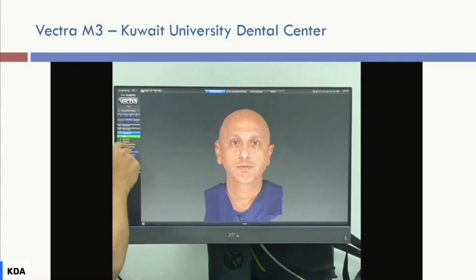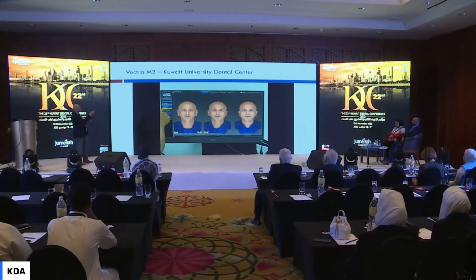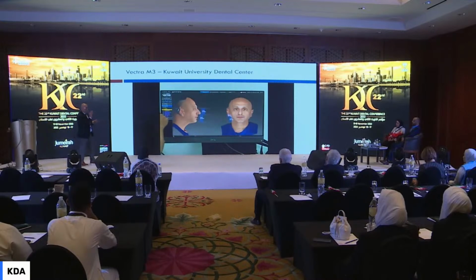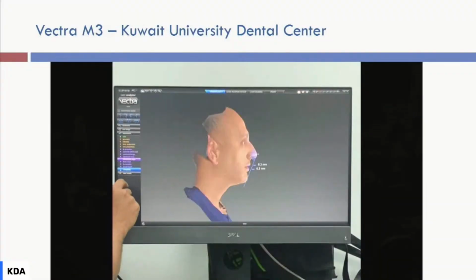We can go into assessment, so you cannot read here, but you can say, let's go about assessing, for example, facial proportions. You can look at the facial proportions that we're talking about, like how many portions of the face, what is the percentage. Here I'm superimposing the right on the left and the left on the right. So my face, if the side is duplicated. That was the facial proportion, the anterior fifth. I can look at the nasal angle. I can look at the dorsum. Pretty much you can evaluate the cephalometry of the soft tissue of the face in complete detail.